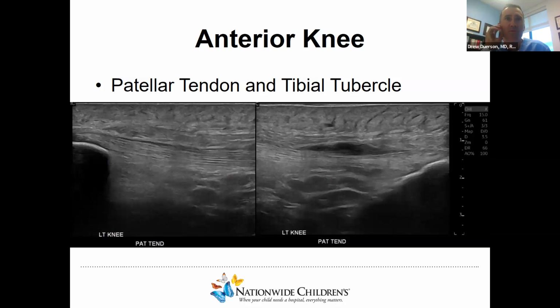All right, so now we've had a good look proximally. We'll move distal and look at the patellar tendon. So I often will do an extended field of view image to get the entire length, because you can't get that with just one transducer width. But in this picture, we'll just piece two pictures together, and we see a nice normal proximal tendon that looks fibrillar, homogeneous, normal appearing. And then if we look at that more distal tendon, we start to see something that catches our eye.